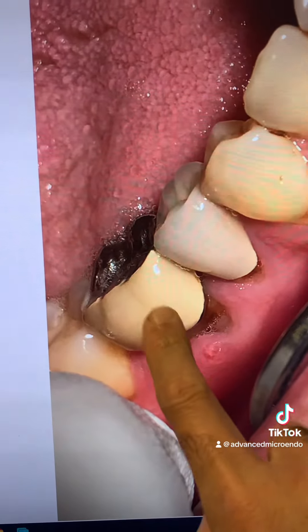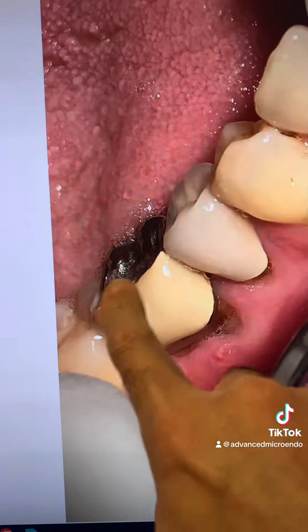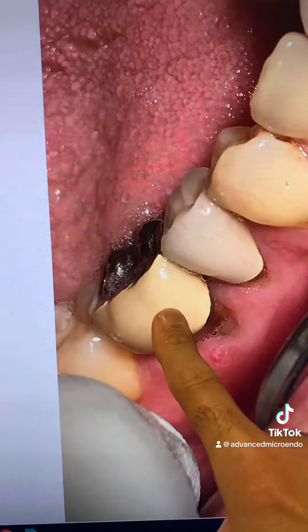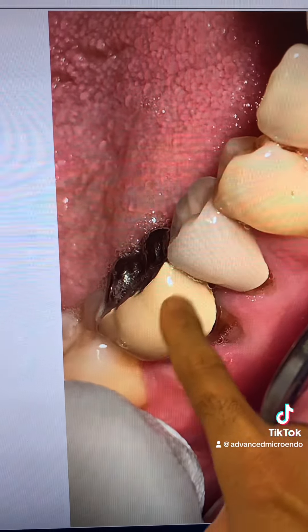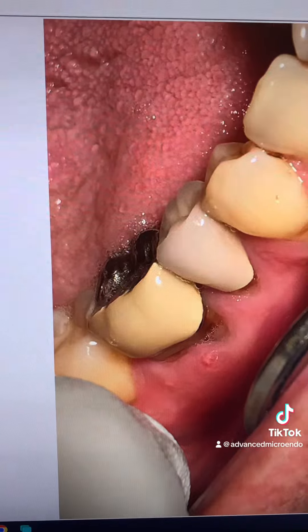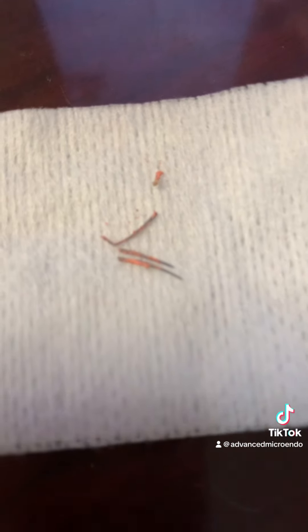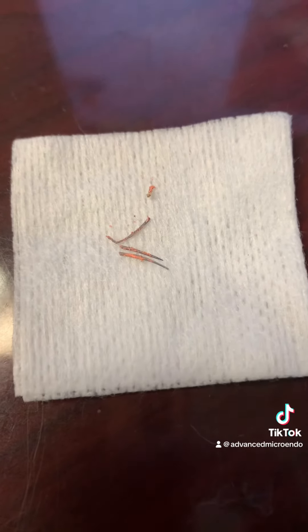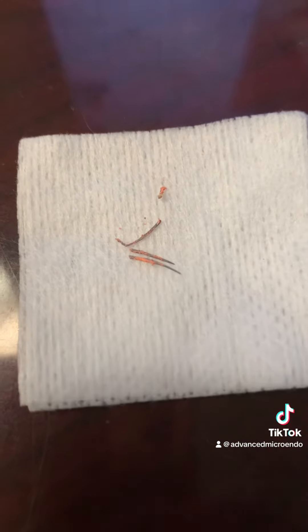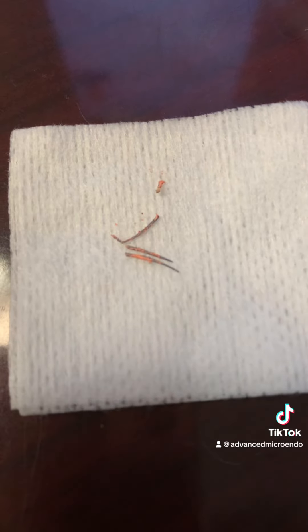You can see the PFM crown with metal occlusal. So today we went through that PFM crown, removed the buildup, and removed the plastic thermoplastic obturators as you can see right here.